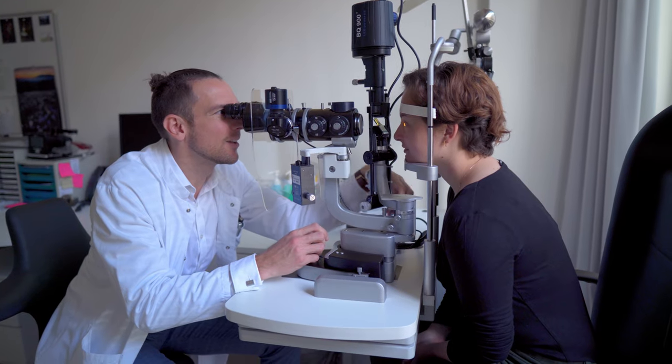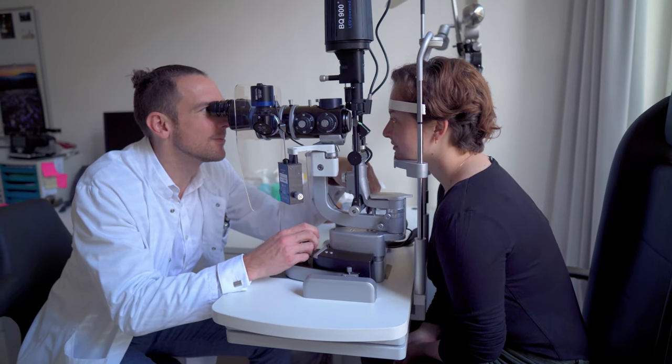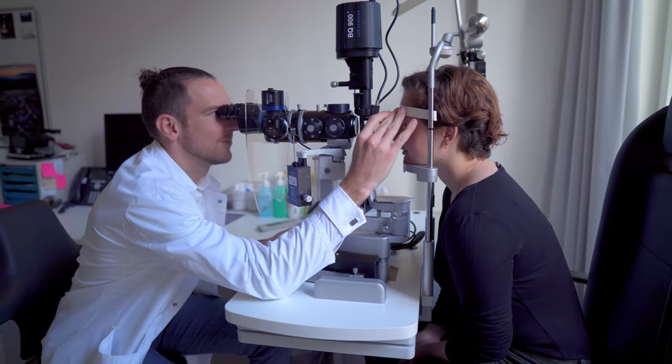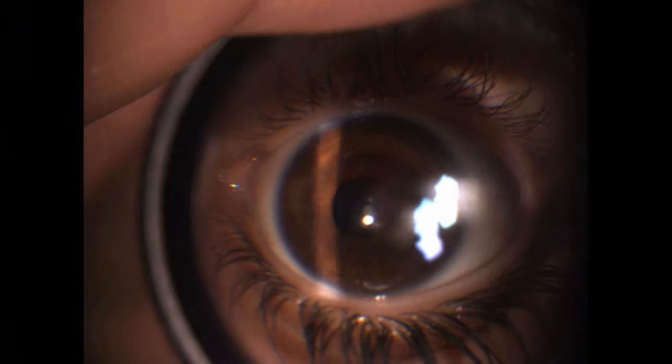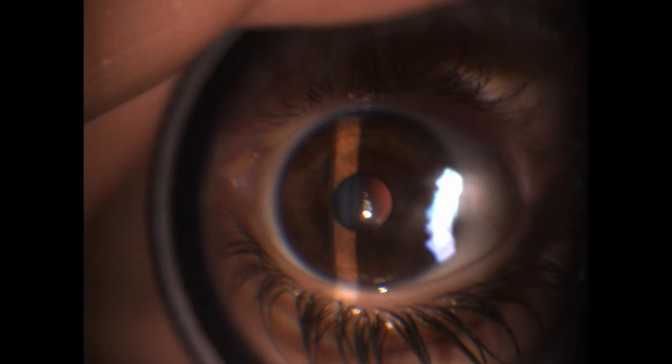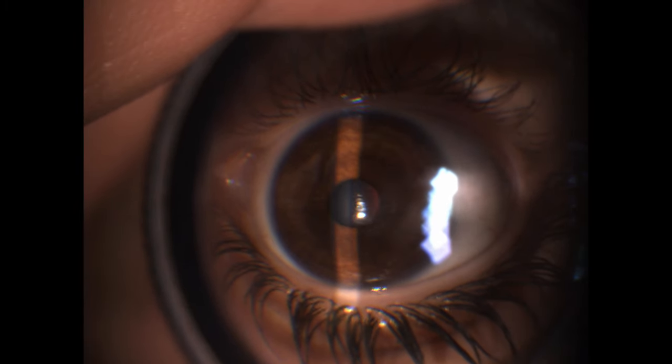While most residents find it pretty easy to learn the anterior segment examination, almost all of them struggle with the fundus exam. This is especially true for the fundus exam in an undilated patient or a non-compliant patient.